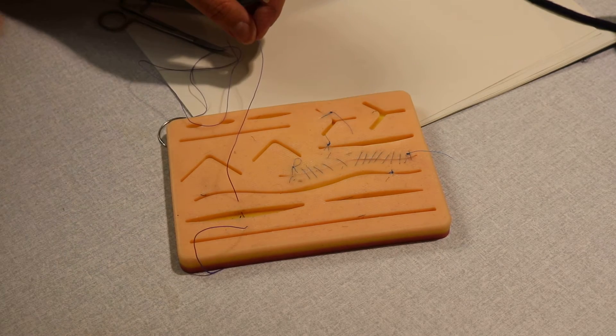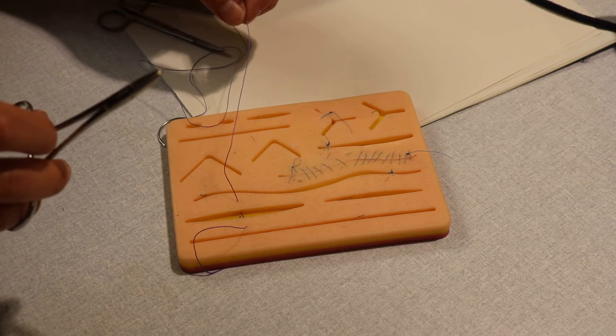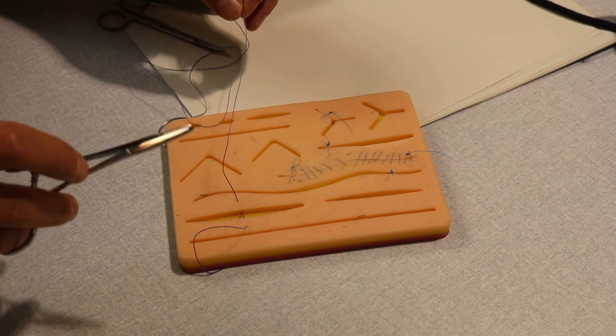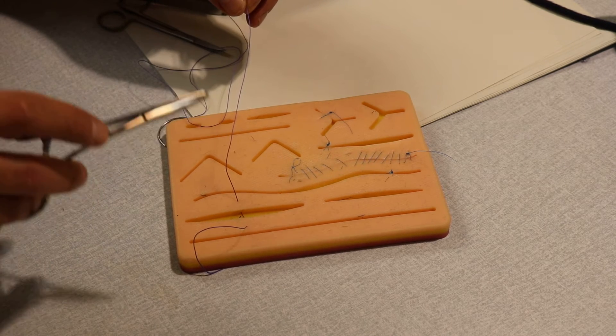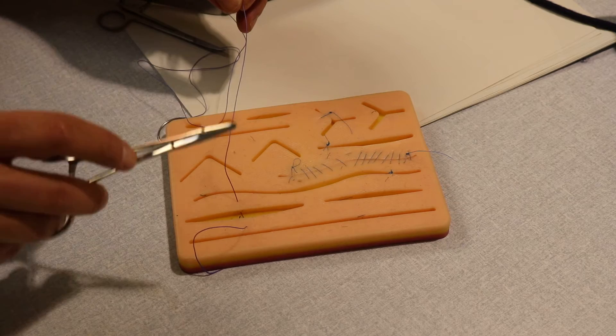How to tie is the same principle. It's a reef knot or a surgeon knot, and how to do that with an instrument.